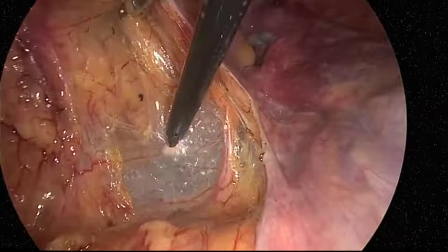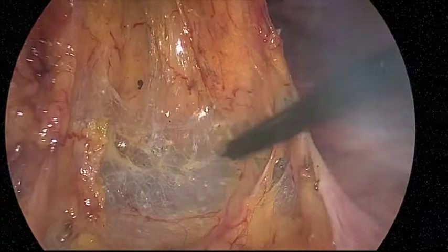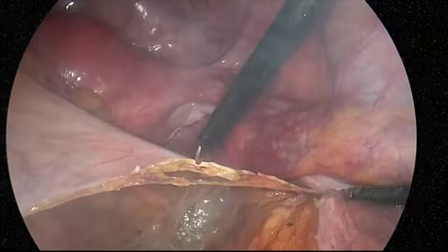The retrorectal space is dissected. The bilateral hypogastric nerves are identified and preserved. The retroperitoneum at the right side of the upper rectum is dissected, as is that at the left side.